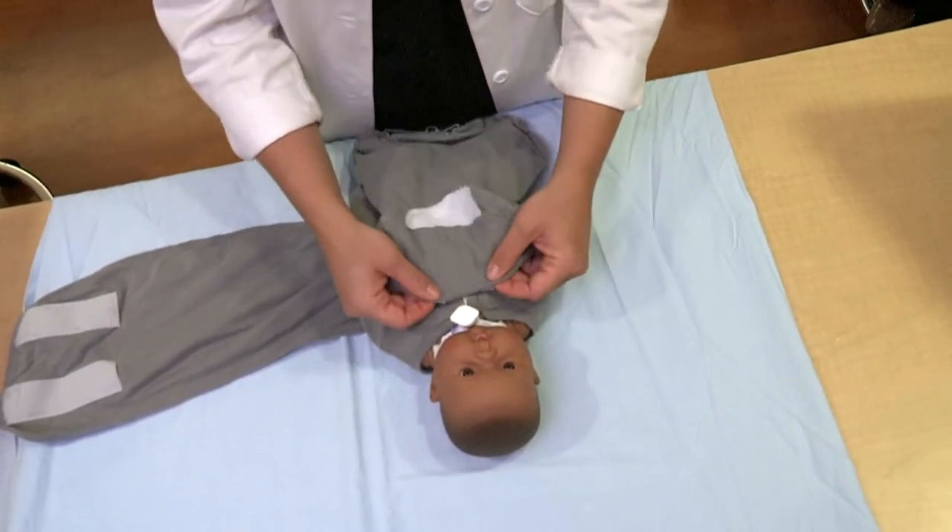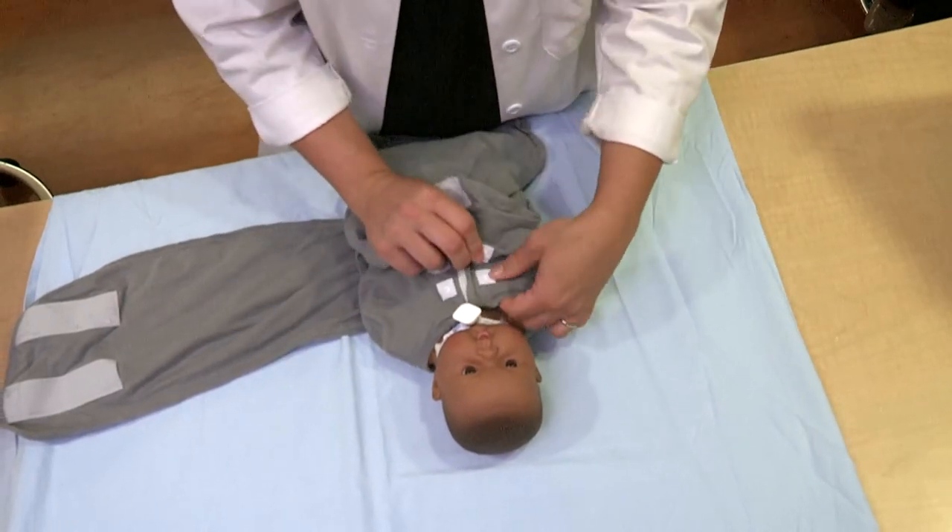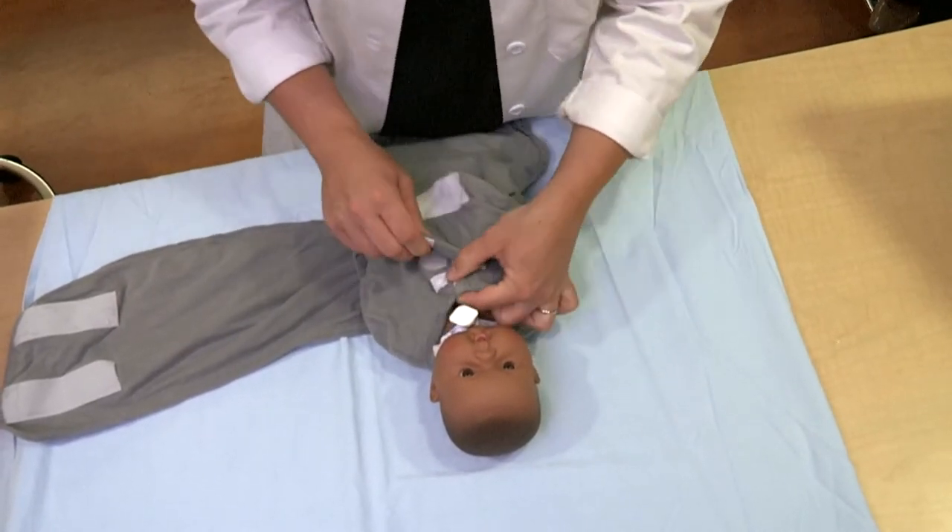When using an M-Bay on a smaller baby, consider the length adjustment feature. When snapping at the top, simply fold the Velcro tab down.